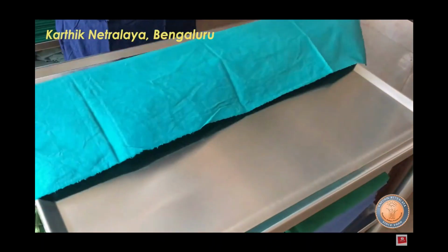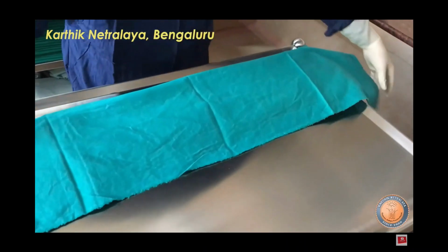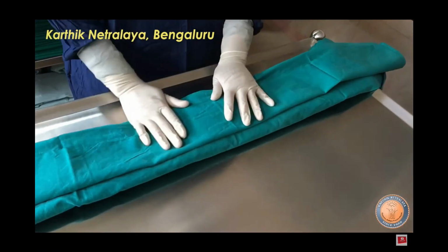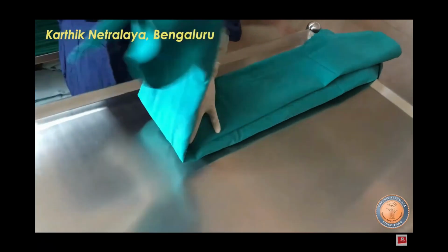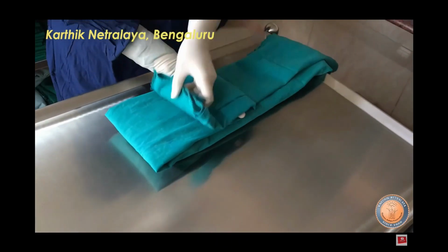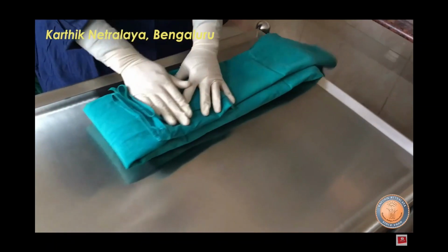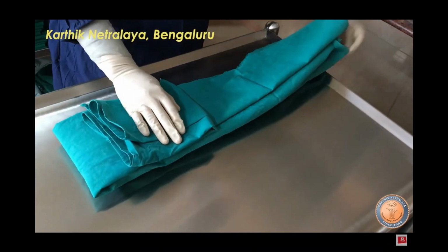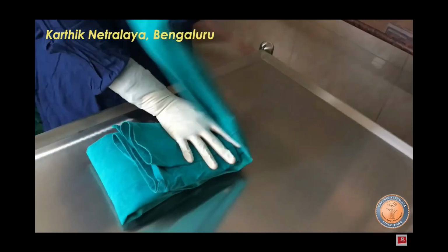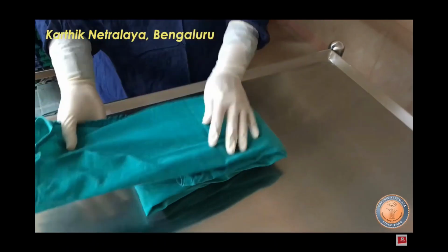The instruments need to be dry, and they can be dried with a towel or with a hair dryer. We have a hair dryer which is used. But what is most important is cleaning the instruments as soon as surgery is over without wasting any time. The cleaning team is totally separate, and they pack it and keep it ready, and then you don't have to be really bone dry.